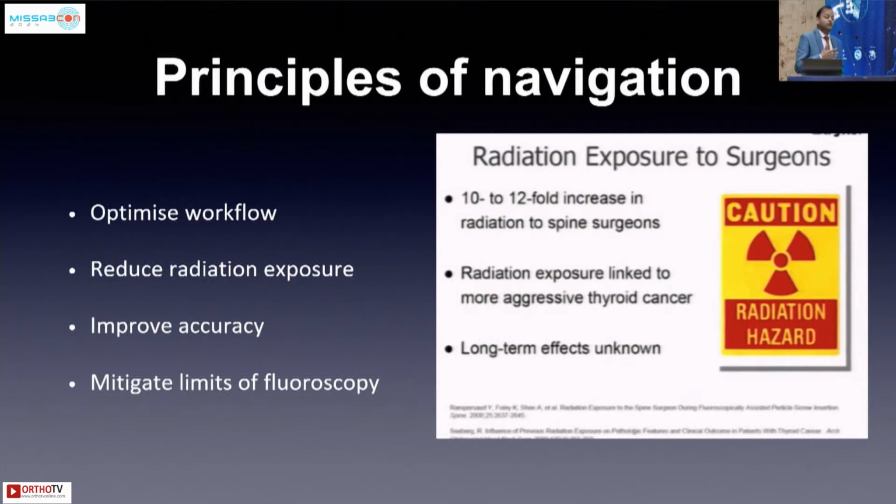I'm stuck in a situation between a hard rock and a brick wall, where I have got the navigation but haven't got the O-arm or 3D arm. We bought the navigation system a year and a half back, but haven't got the 3D. So either I would start doing only X-ray based, or I innovate myself and do a navigation based on 2D images. So why do we need navigation?